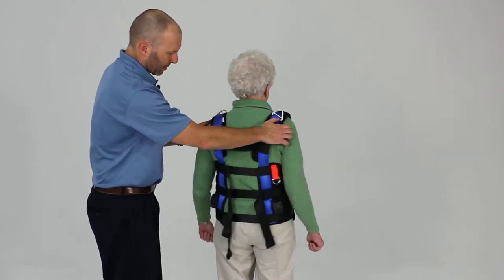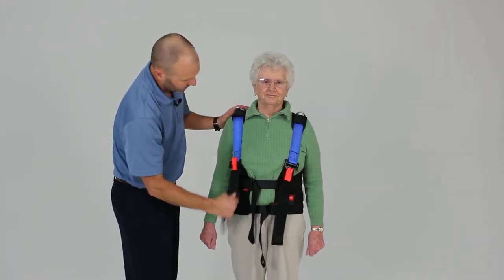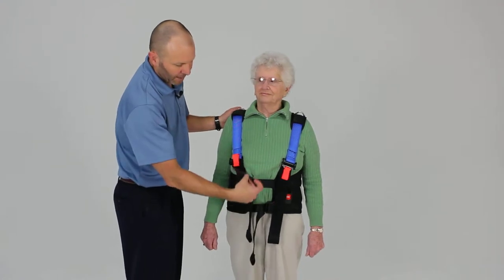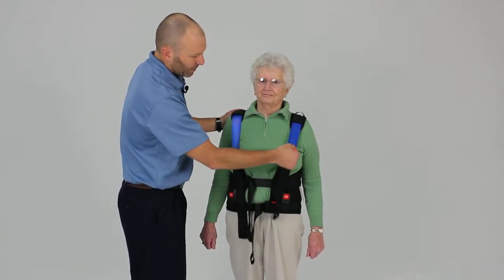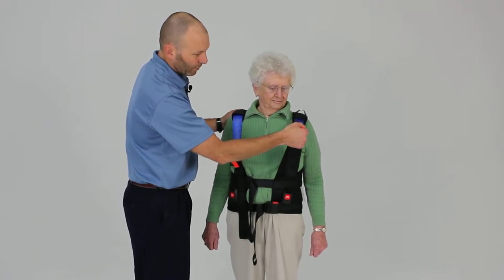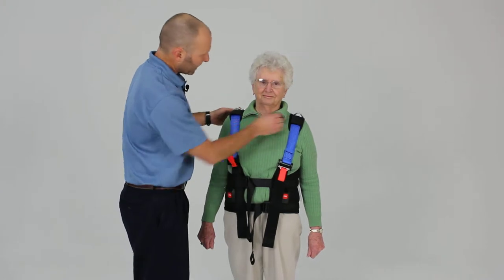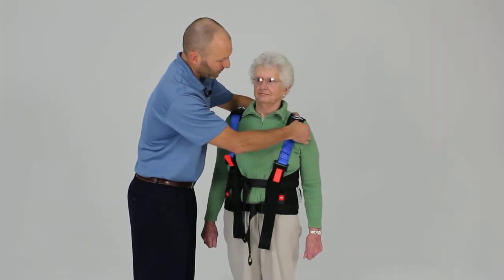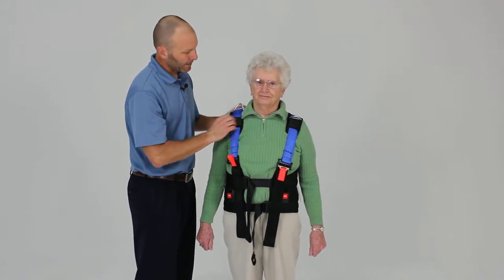Good position there. I'm going to tighten up the shoulder straps just a little bit so they don't fall off. You tighten the shoulder straps by pulling down on the free end, the black webbing. To loosen those, you just pull up on the red or orange webbing to release that. It does have a shoulder pad that can be moved and adjusted to the patient for comfort, so it can slide forward or back a little bit.